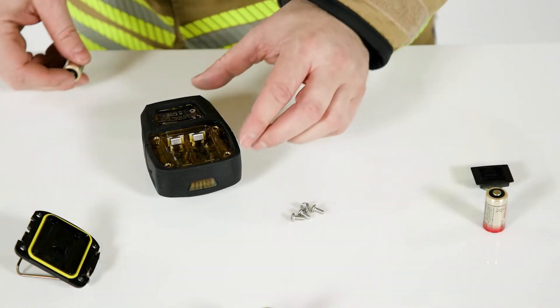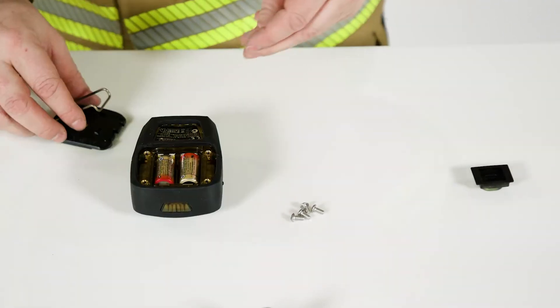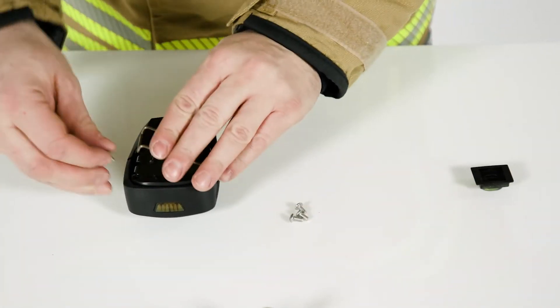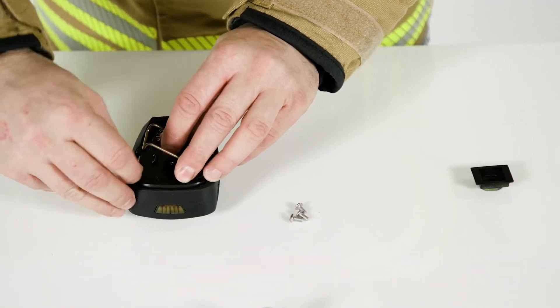Replace the batteries. Only use batteries approved by Dräger. Reposition the lid. Retighten the screws. Do not over-torque. Attach the lid.